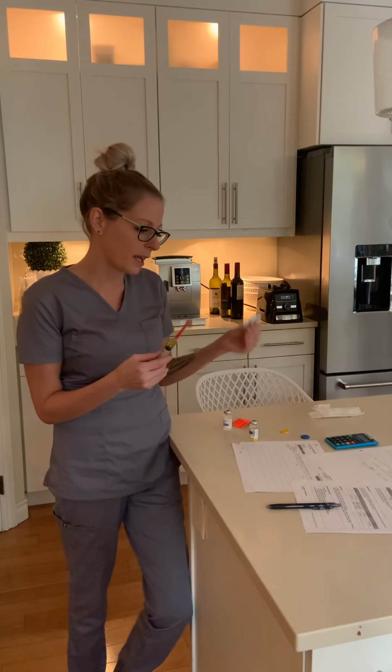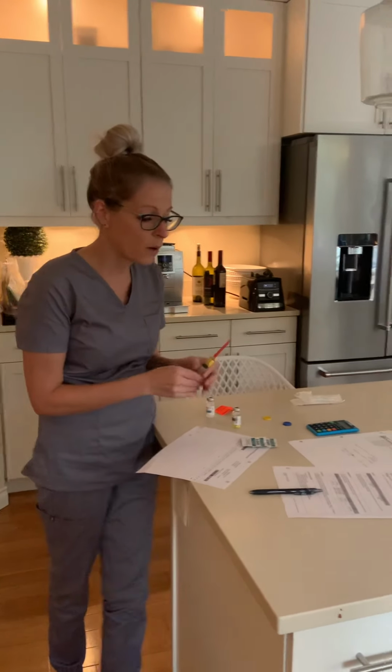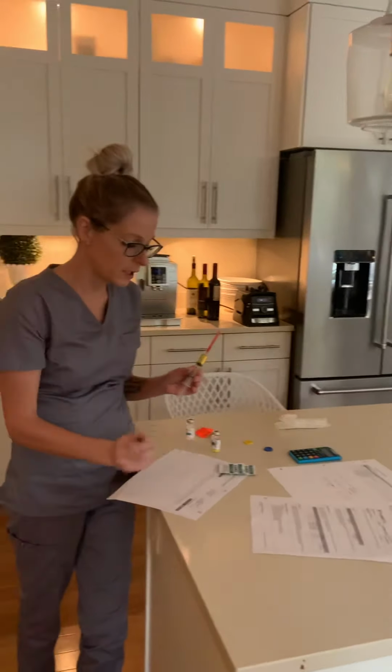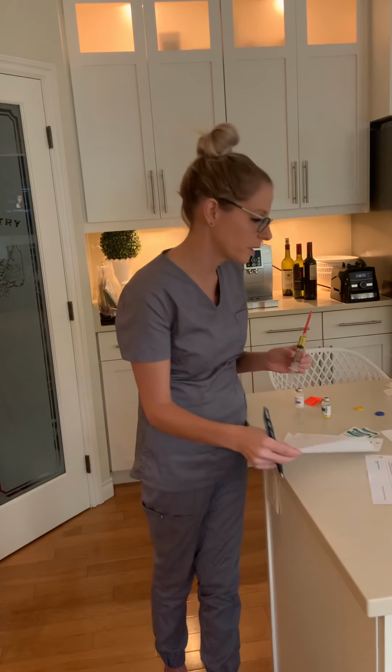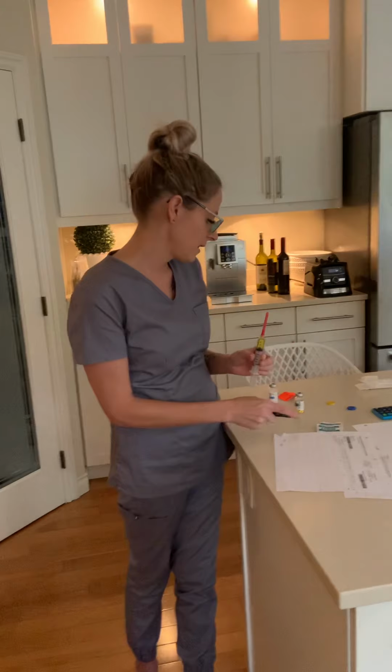I would go, again, prepared with the medication. Once it's drawn up, I would circle, take this to the patient's bedside, compare the identifiers, and program the pump with the assistance of my clinical instructor. And I think that's it.